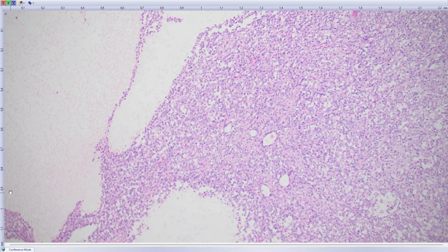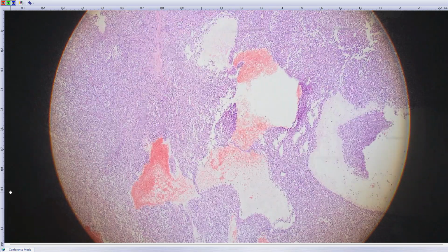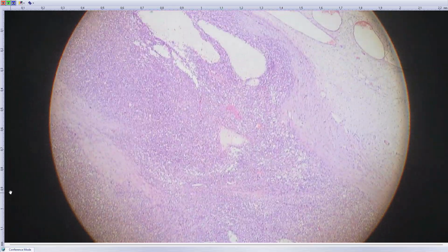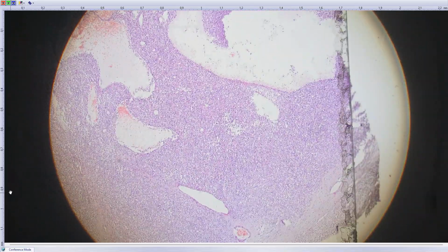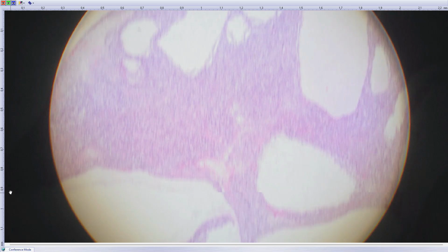Did you have mucinous glands in it? No, there were no mucinous glands. I never saw them, but they write about it. It may appear, but I never saw them. Maybe they are somewhere, but they are not described in the histology. If you find some, you should show me, and I will lose my virginity. I will show you then, but they are not here.